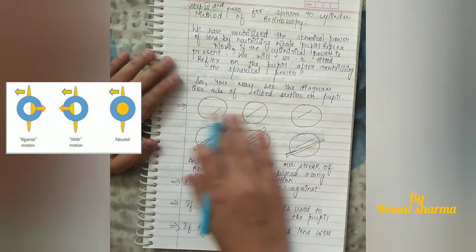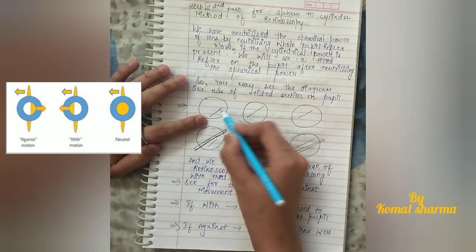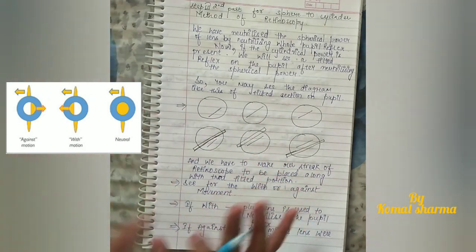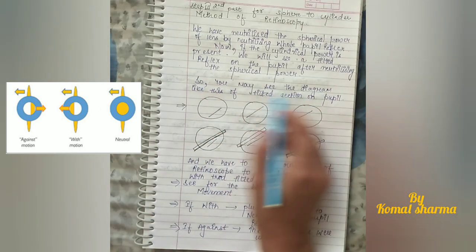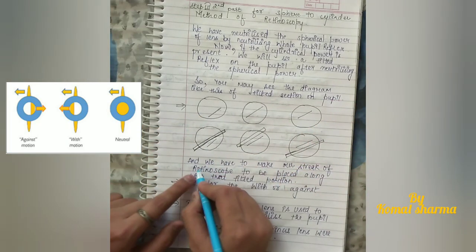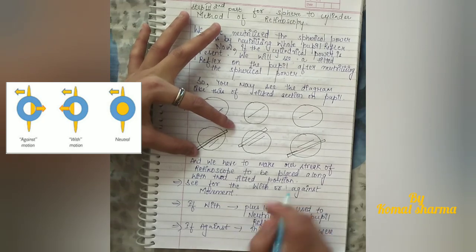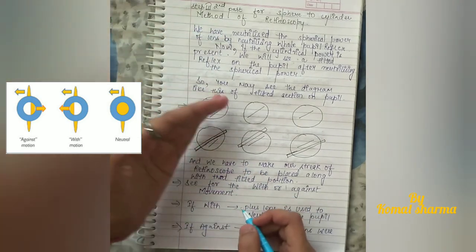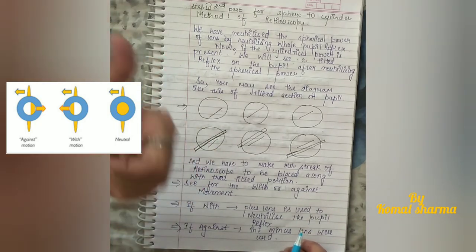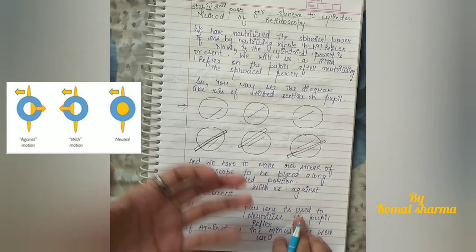There will be a tilted reflex visible after neutralizing the whole pupillary reflex with the spherical power lens. If cylindrical power is present, we see that tilted reflex; if it is not present, we won't see any tilted reflex — meaning the patient has only spherical power. You may see the diagram of this tilted reflex on the pupil. We need to place our streak of the retinoscope along that tilted portion to neutralize it with a cylindrical power lens.